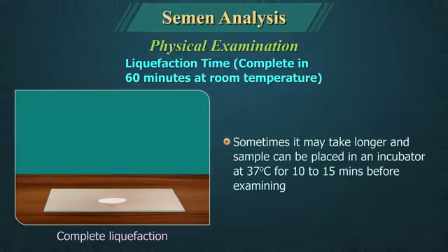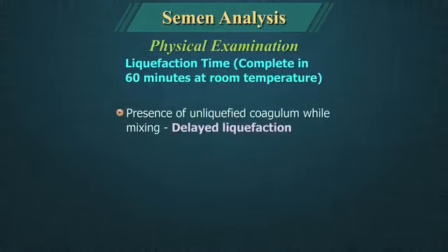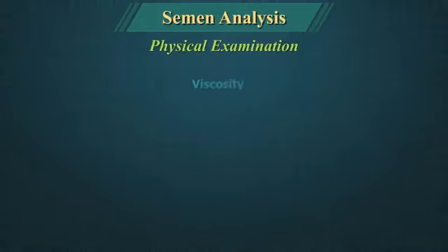Sometimes it may take longer and the sample can be placed in an incubator at 37 degrees centigrade for 10 to 15 minutes before examining again. Failure to liquefy or delayed liquefaction may indicate inadequate prostatic secretion. Presence of an unliquefied coagulum while mixing is indicative of delayed liquefaction.